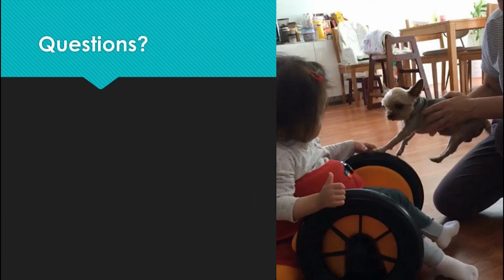If nobody has any other questions, I think that might be us, Natalie. Oh, no, one more. This is from Jerry. Is there more research available about effectiveness in comparison to more standard wheelchairs? I can answer a little bit. There's not really a lot of mobility for this age group because they don't really go into wheelchairs until they start going to school. There is research out there talking about independent mobility, or people that try to create something mobile for toddlers that does promote their speech and socialization, versus there's really no standard wheelchairs for this age group right now.